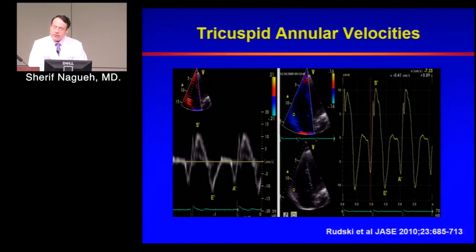Some physicians ask for these measurements. Obviously, physicians who ask for these measurements should be familiar with their limitations and what they mean.